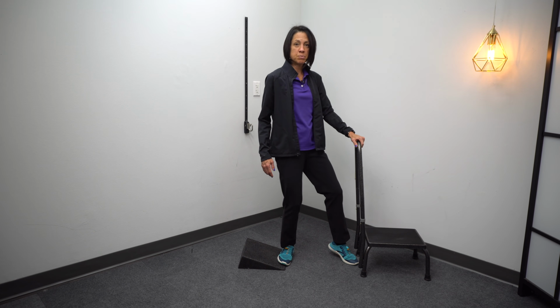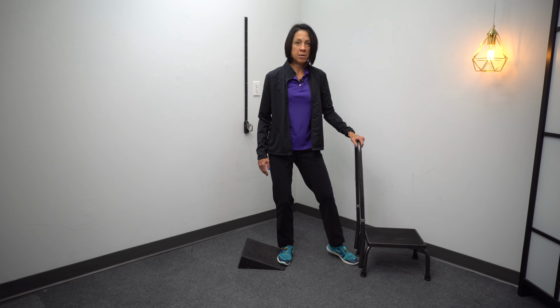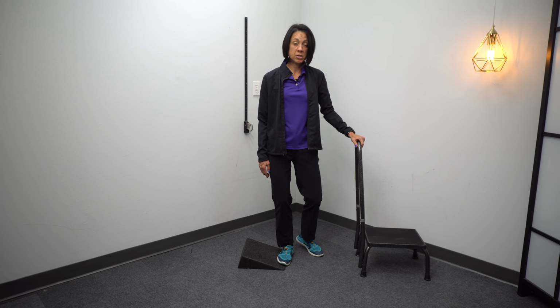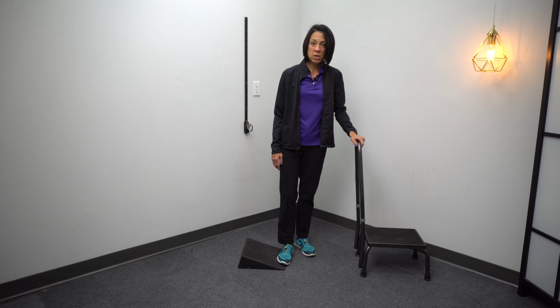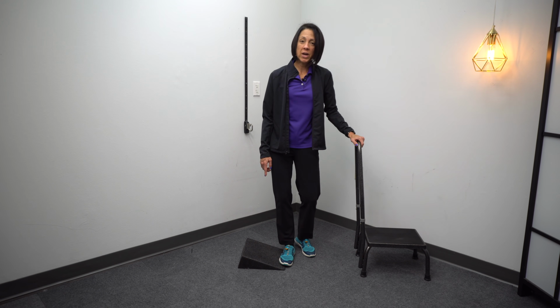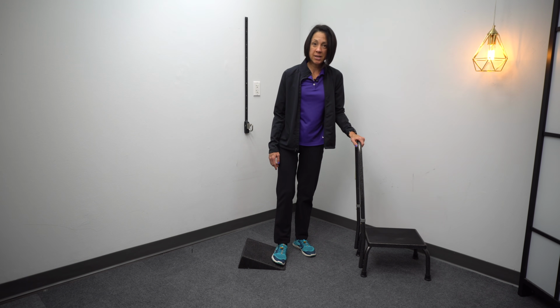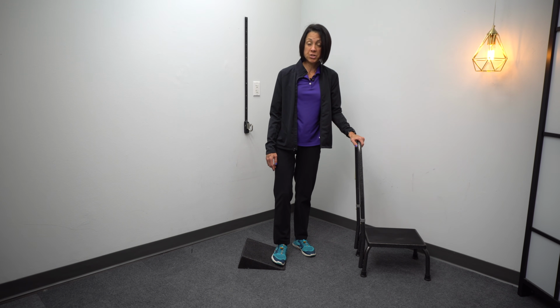So you don't want this position, but you don't want this position. So a happy medium I usually find is to have it slightly over the big toe. For some of you, that might mean that when your foot's just barely on the wedge, your leg is like this, and in that case you'd want to move your foot up the wedge just a little bit.